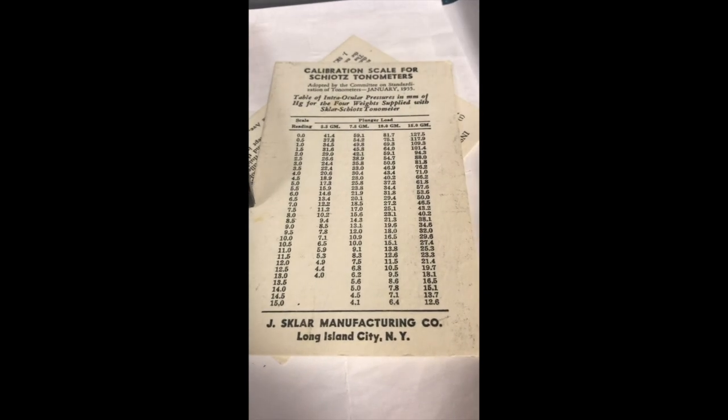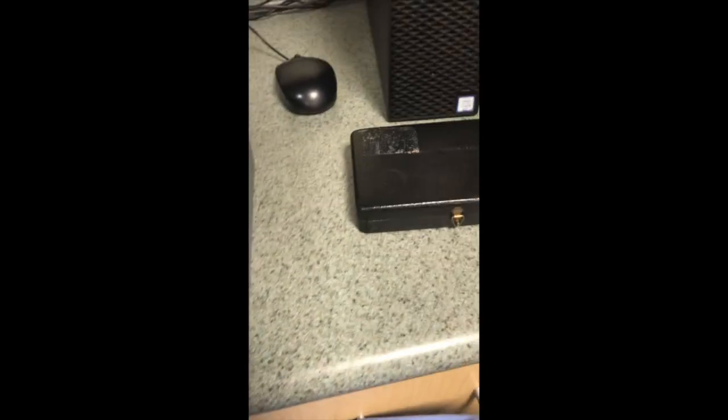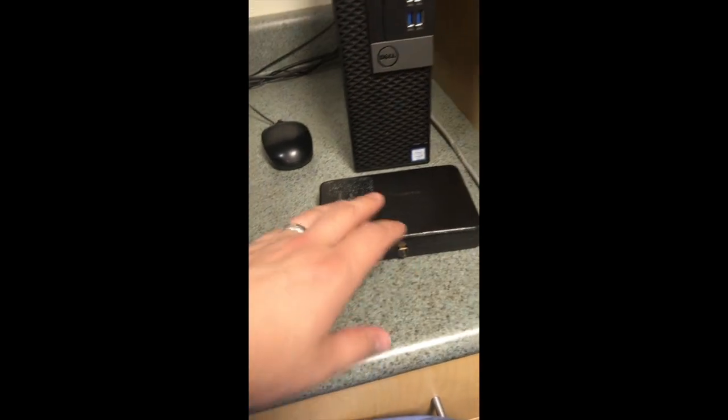The other thing that you'll need from this case is this conversion chart, which comes in there. And there is some instructional documentation as well from 1956, which was the last time that this appears to have been updated.